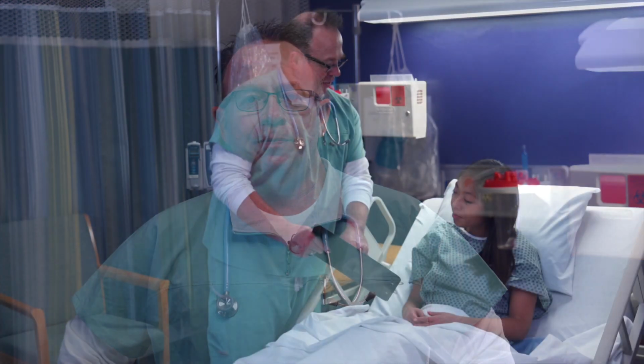In today's video, we will cover in detail the entire process of how to insert a Foley catheter in a female patient, including pre-insertion activities and proper securement of the Foley catheter. Proper technique is critical to avoid introducing infection-causing organisms during the process. Bottom line, minimizing the risk of complications such as CAUTI associated with indwelling catheters begins with aseptic insertion.